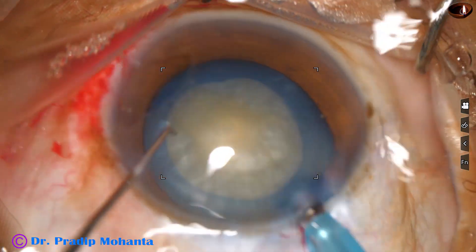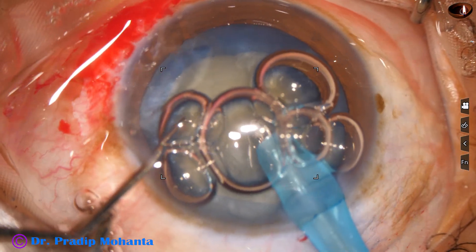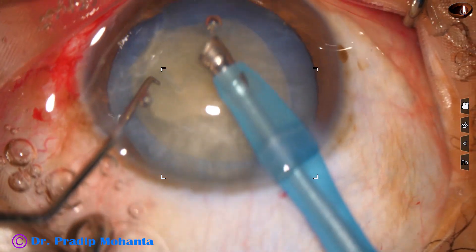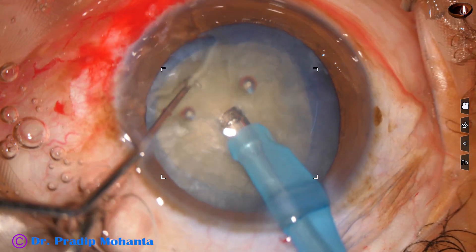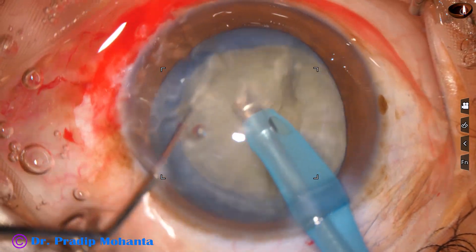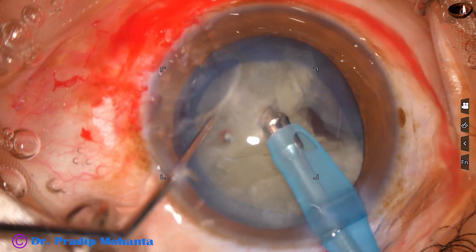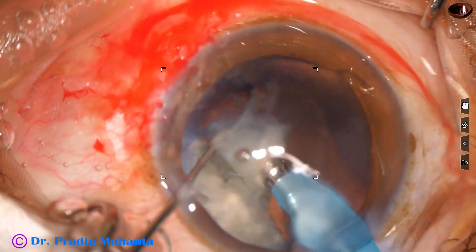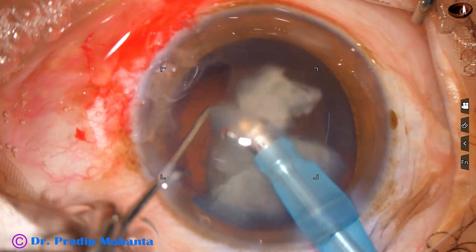Now I am going to manage the nucleus. I use aspiration to remove the air bubbles. Now I divide the nucleus by direct chop — hold the nucleus with vacuum and chop it, rotate the nucleus, chop it at another place. The free nuclear fragments can be emulsified now or later. In this case, I am emulsifying the pieces as I make them free from the main mass. Most of the nucleus has been removed.